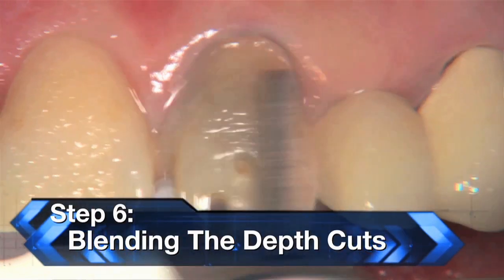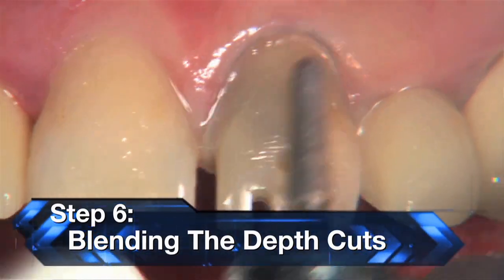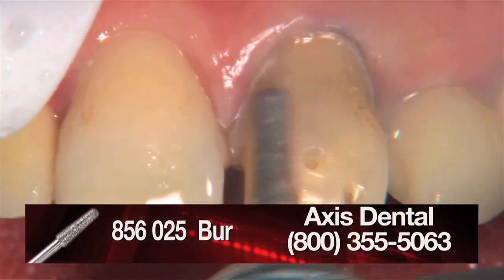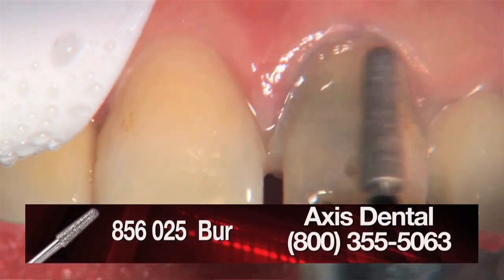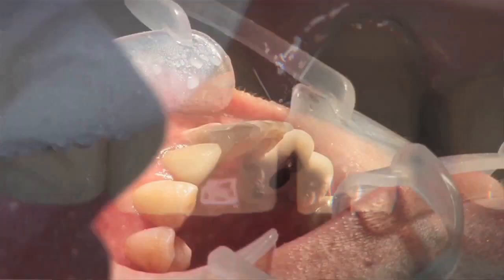Once we've done all that, we're ready to blend the depth cuts, and now it's just a matter of drilling till we don't see any holes anymore. So we're going to use that 856-025 bur that I said was kind of the workhorse of this technique. And just start on the facial surface by blending these depth cuts together.